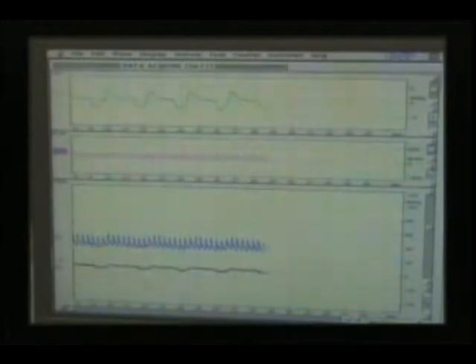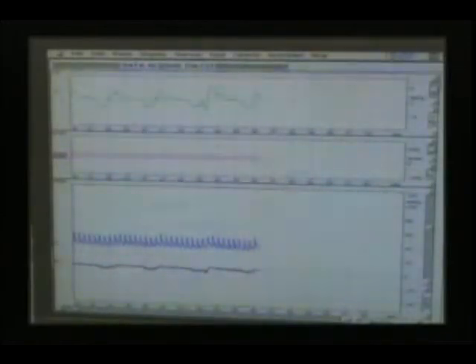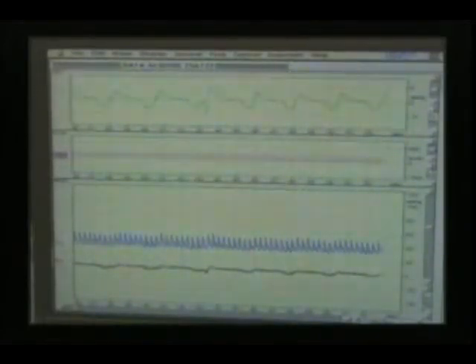After 5 minutes of recovery, the systolic blood pressure is approximately 42 and the diastolic blood pressure approximately 30 millimeters of mercury. The intrathoracic pressure or airway pressure is varying between +2.5 and -2.5 millimeters of mercury. Maximum carotid artery blood flow is approximately 200 ml per minute, and the right atrial pressure and intracranial pressure are shown dipping below 0 millimeters of mercury with each inspiratory effort.